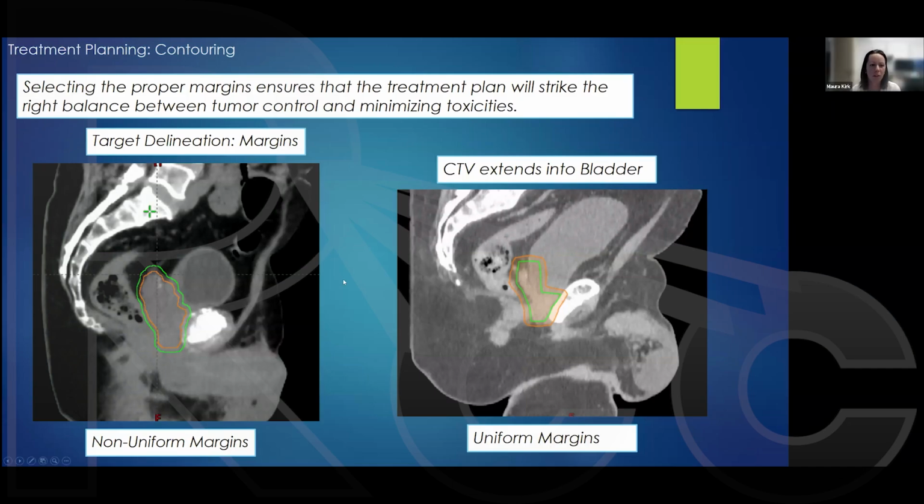And I guess that would be also with alignment to markers in the prostate, right? Yeah, we'll get into that alignment topic a little bit, but yes, having good alignment is where this comes into play. If you're using MV 2D planar imaging, you can obviously get good markers that you can see and you're aligning the prostate, but you have no idea where that rectal wall is, for instance. And so having volumetric imaging in combination with those margin reductions is the key to ensure that we're treating what we need to be treating and avoiding what we need to be avoiding. Okay, thanks. All right, thank you.